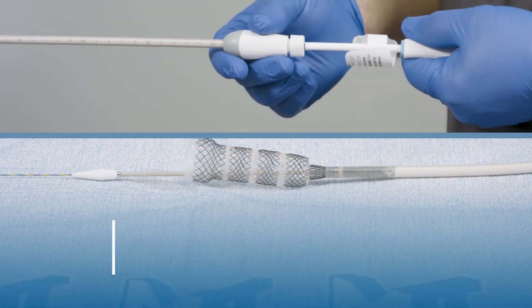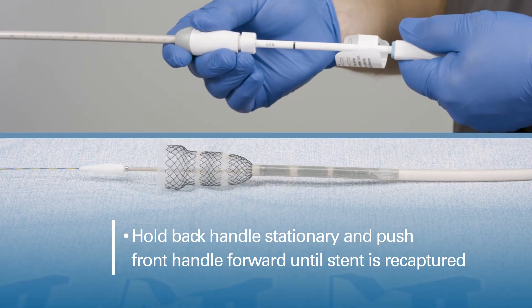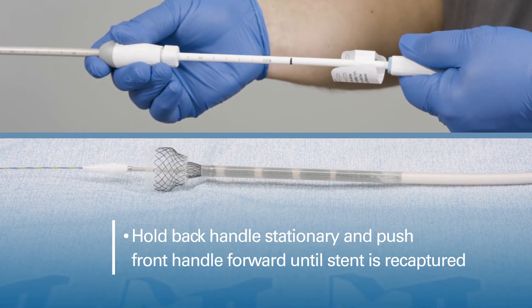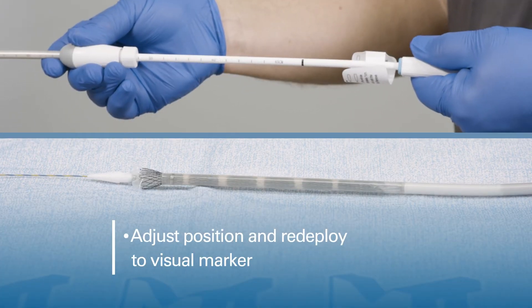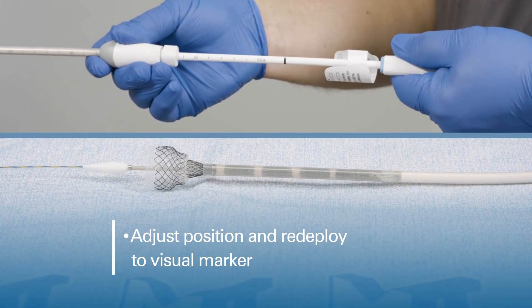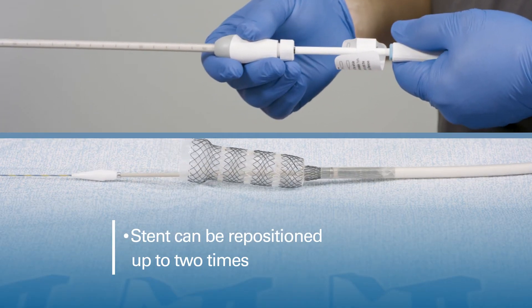To recapture the stent, hold the back handle stationary and push the front handle forward until the stent is recaptured. Adjust position and redeploy to the visual marker. The stent can be repositioned up to two times.